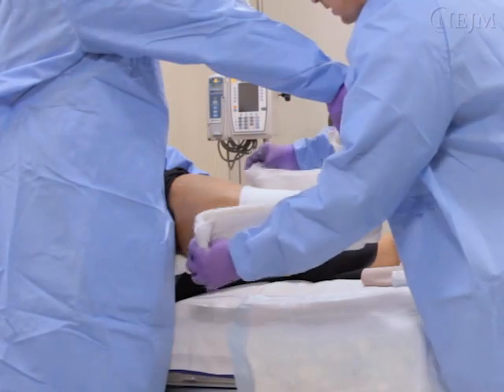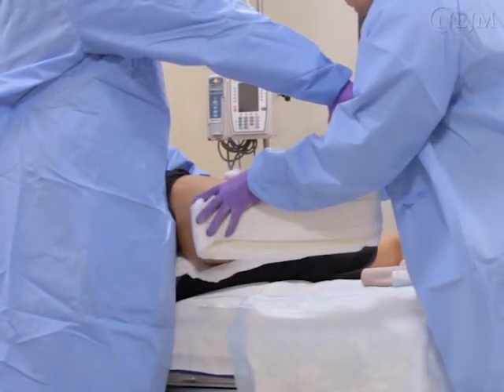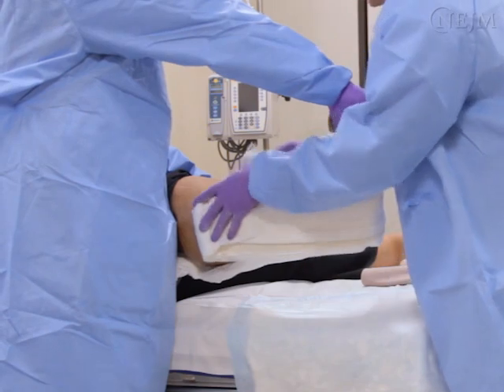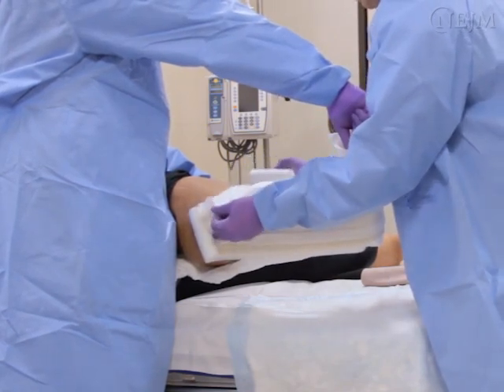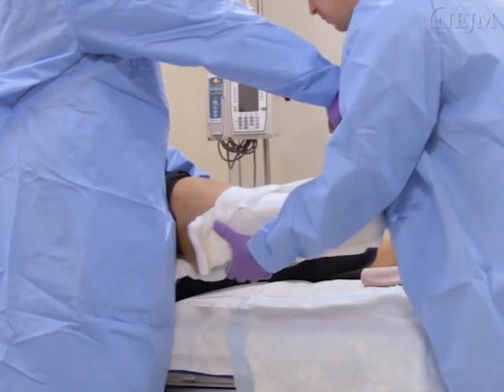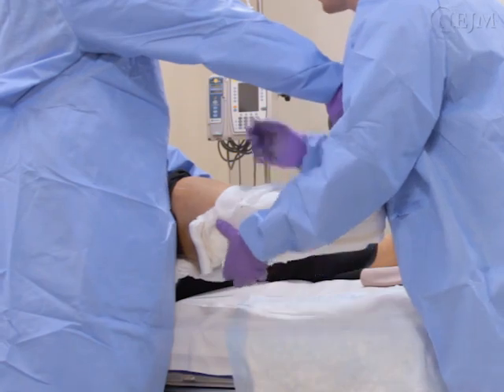Next, apply the U-slab. Ensure that the slab covers the lateral and medial malleoli. An additional layer of padding is useful to hold the splinting material in position and to prevent the plaster from sticking to the elastic bandage.